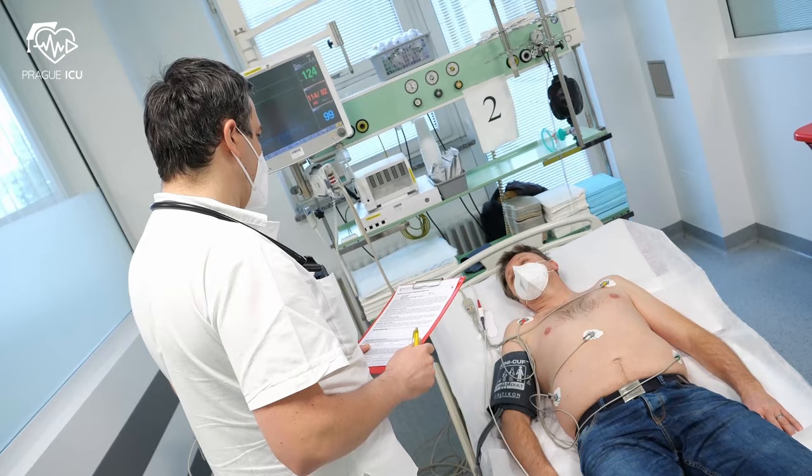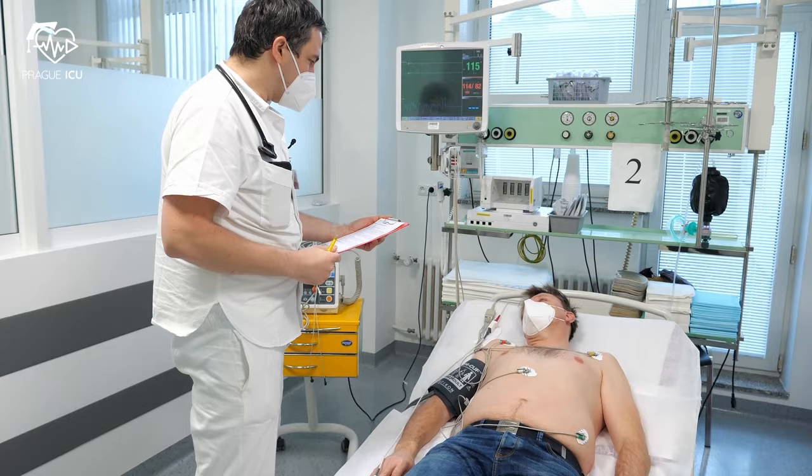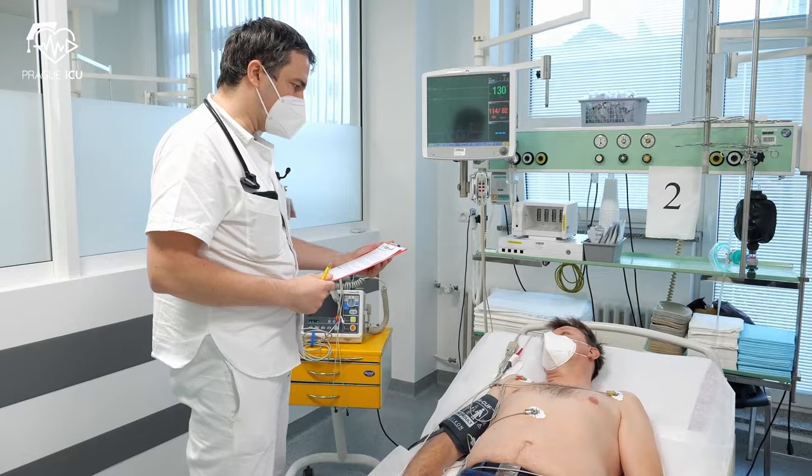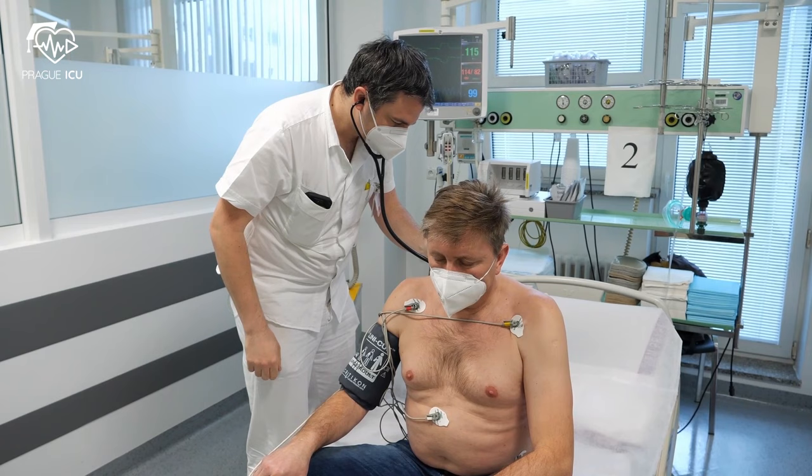First, check persistency of atrial fibrillation and other indications and contraindications for the procedure, such as fasting time. Always double check proper anticoagulant therapy and possible need for transesophageal echocardiography before the procedure.